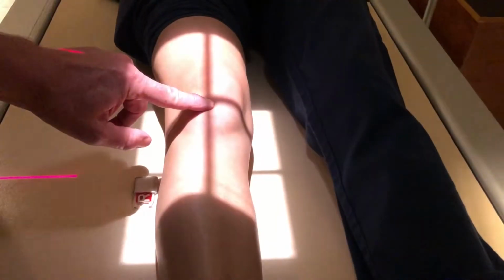We're going to take 4 pictures of a knee. So the first one we're going to do is an AP. So we're going to collimate down to a 10 by 12 light field. We're going to center a 1/2 inch below the apex of the patella. So here's the patella, this is the apex, and the 1/2 inch is just a little bit below that.